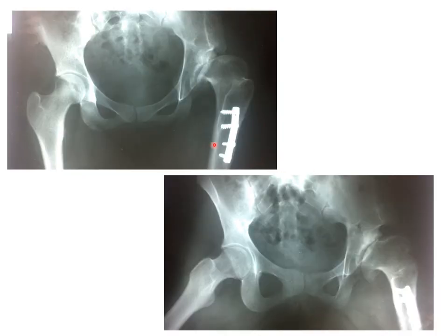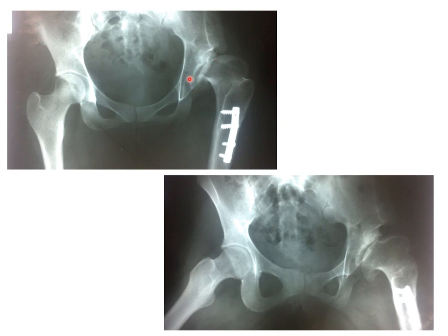She came on the 5th of July 1989 to have the K-wires removed. Back to the current situation: she has obvious shortening due to proximal migration of the femur, a slight angulation on the AP view which is more clear on the lateral view, mushrooming of the head, subluxation, and a very shallow acetabulum, but a good medial wall.